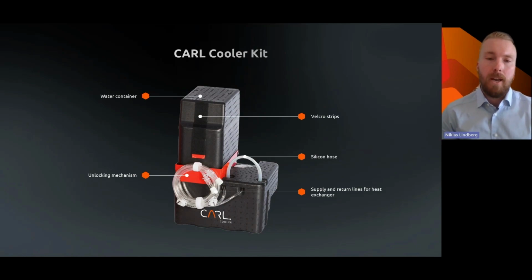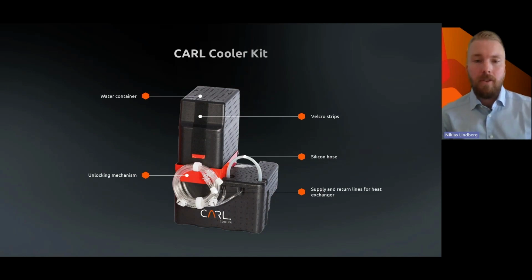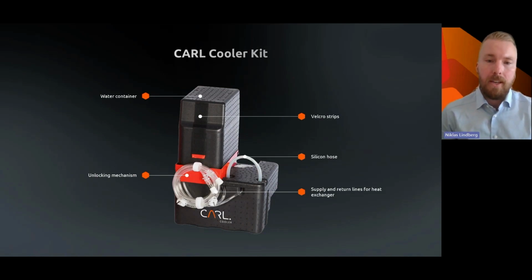On the very top, we have tap filtered water. In the bottom, we have urea granulate. When we pull out that red thing in the middle, we will have a chemical endothermic reaction. The reference is that we can lower a male of 80 kilograms by 3 to 4 degrees within 10 to 12 minutes. So it's extremely powerful, and it's a nice tool if you are a believer in a rapid cooling procedure during cardiac arrest.